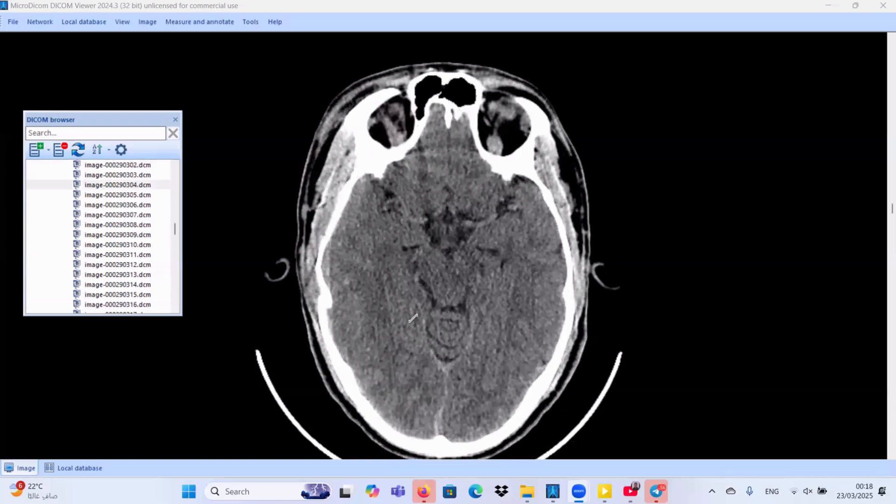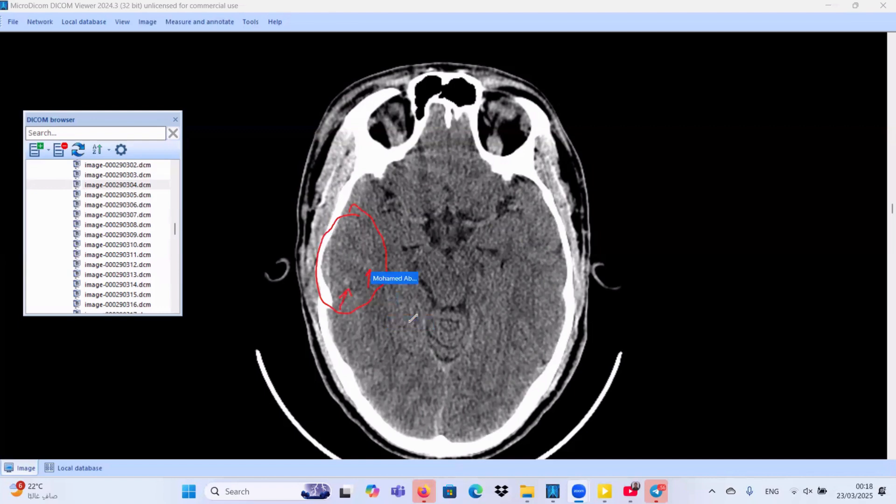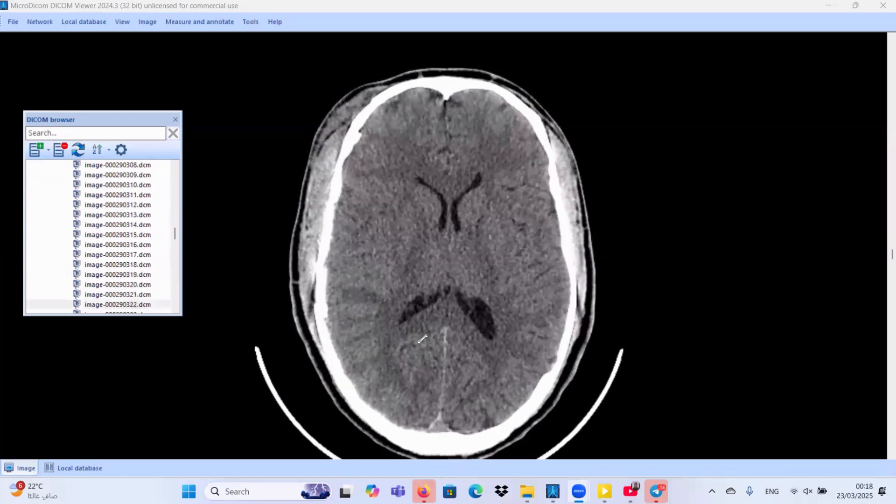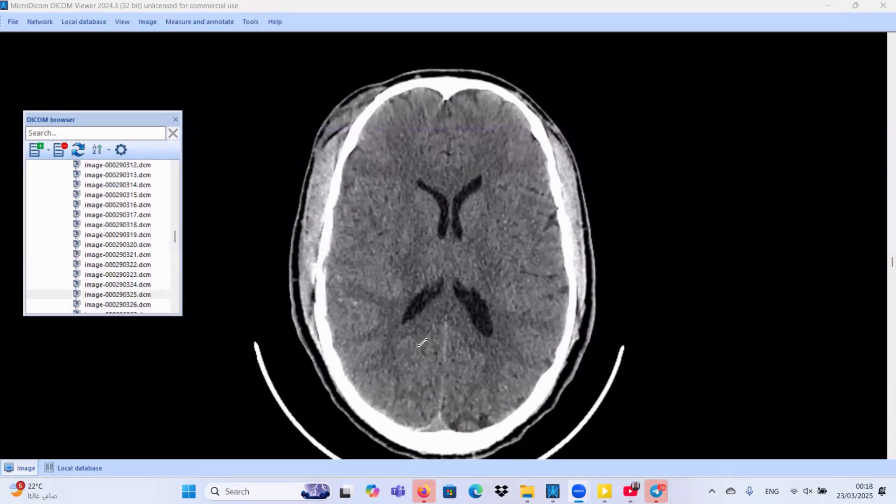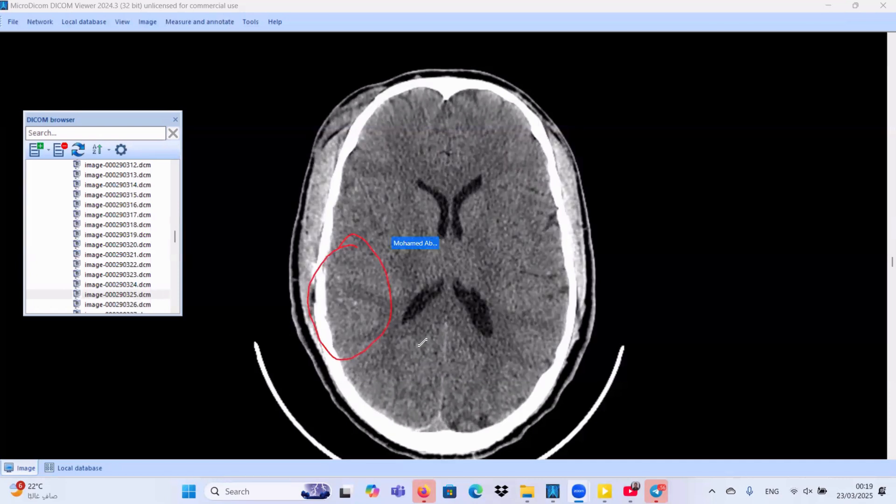We have also similar areas of brain contusion at the right temporal region. Also, at the right parietal region, we have also similar areas of brain contusions.